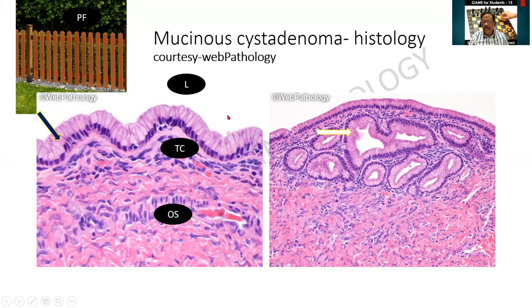And how do you identify it? It is like this. This we call a picket fence. Normally we see it at the sides of the railway station or in a garden. They are all tall columnar, and for them to stay in space, there will be a cross rail that is there, and there will be the nails. So this is supposed to signify the nucleus that I'm seeing over here, and the tall columnar ones will be the cytoplasm.